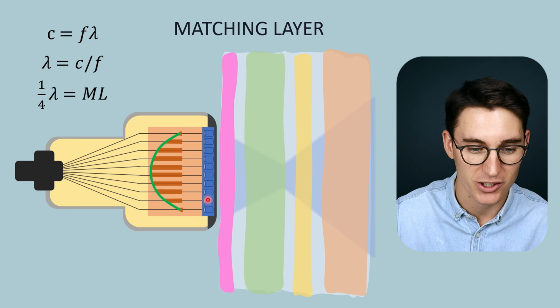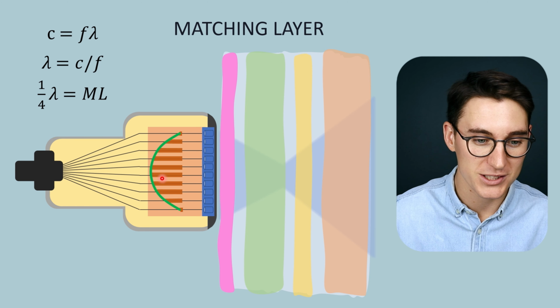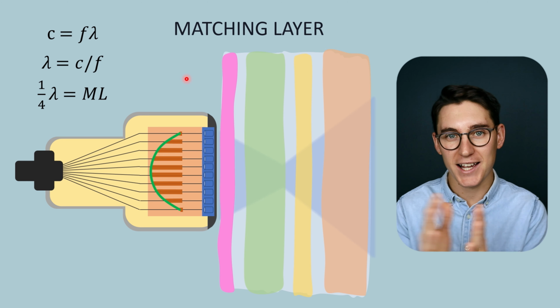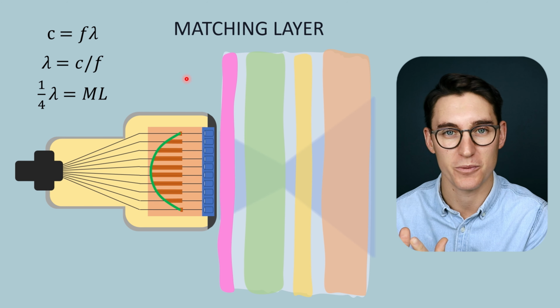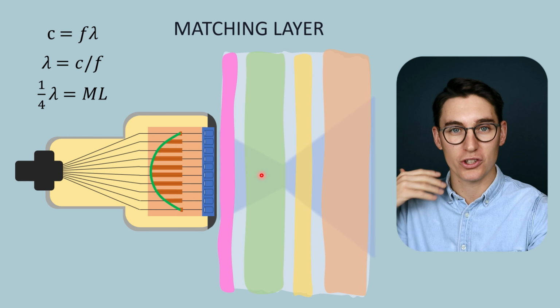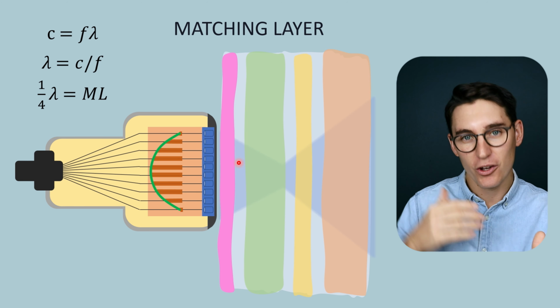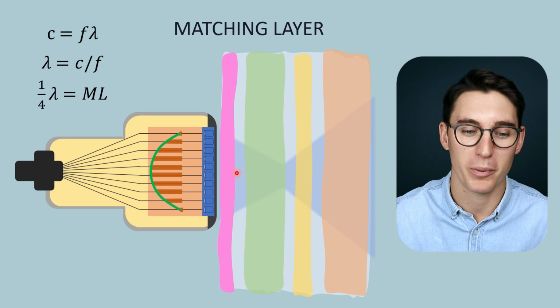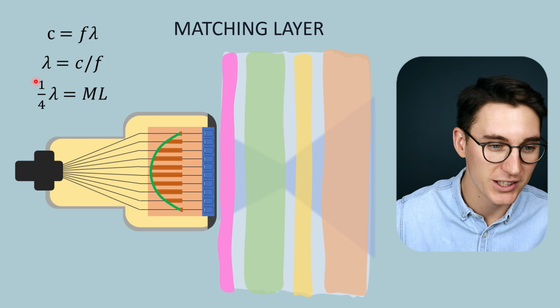It protects these piezoelectric crystals from the tissue outside, as well as protecting the patient's tissue from the internal components here of the ultrasound transducer. Now, the matching layer has an acoustic impedance that lies between the acoustic impedance of our PZT crystals and the acoustic impedance of soft tissue. When we have a high differential in acoustic impedances, we saw that a large proportion of those sound waves will reflect off. This matching layer provides a smoothing of that transition. Fewer of those ultrasound waves that we are creating will be directly reflected back, and more will make it into our patient's tissue.